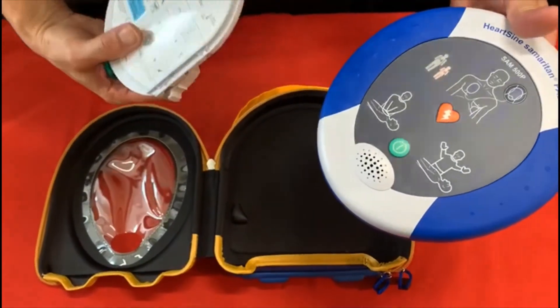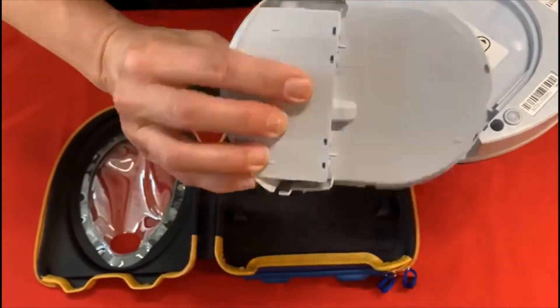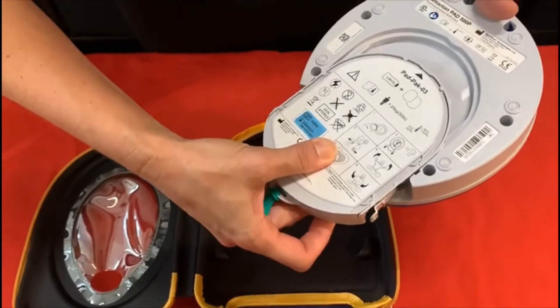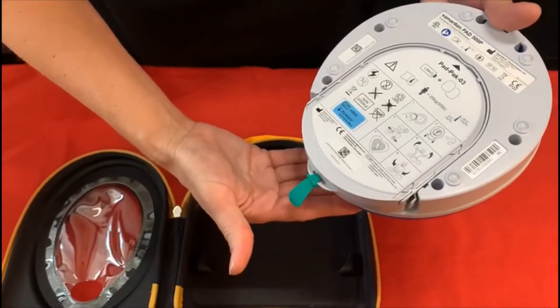Turn your defib unit over. You have your new cartridge. You're simply going to slide it in and it will click into place. Okay, it's all in.